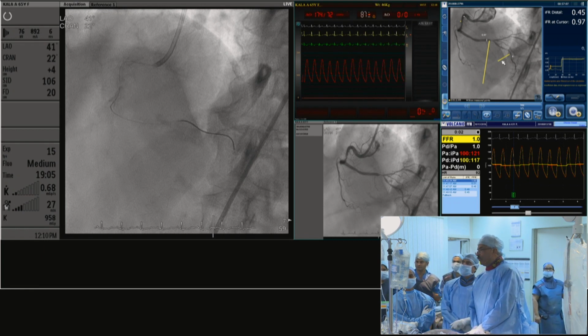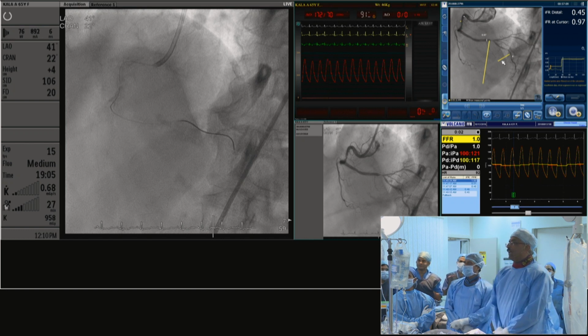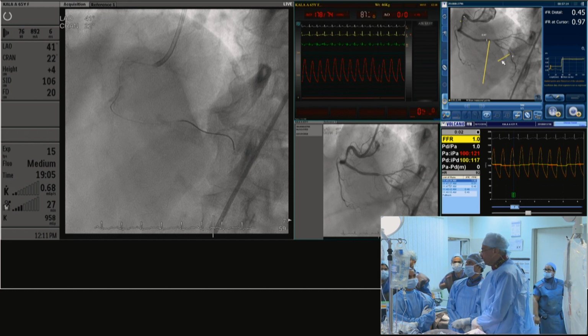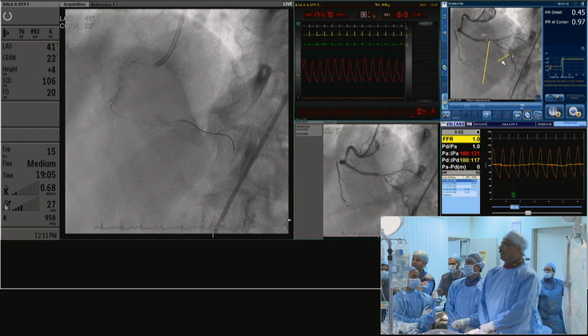Okay, now Sayan Sen is with me, and he will tell you what we found on the IFR. Very interesting. Thank you, Sayan, can you come in? Thank you, Ajit. So a really good case.